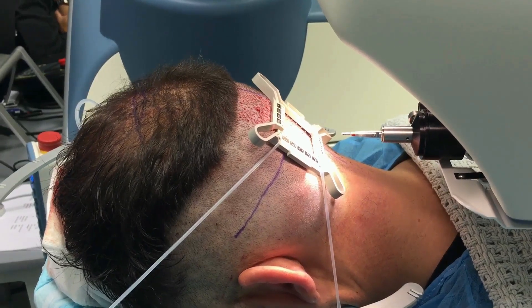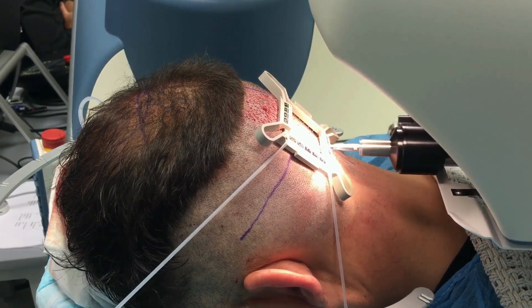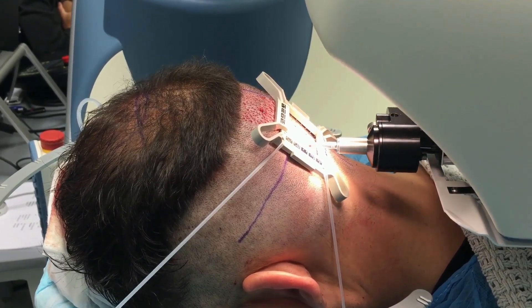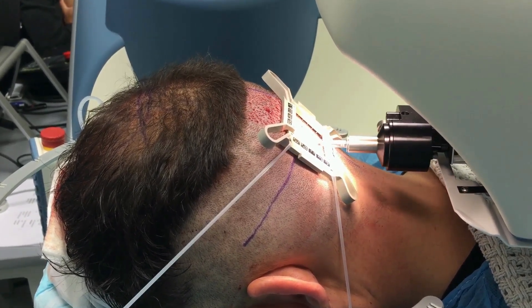Now you can see that the robot has gotten its bearings from the tensioner. There are fiducials — those black squares that look like dominoes around the margins of the tensioner. What this does is the tensioner applies a significant amount of stretch to the skin to make it tense.